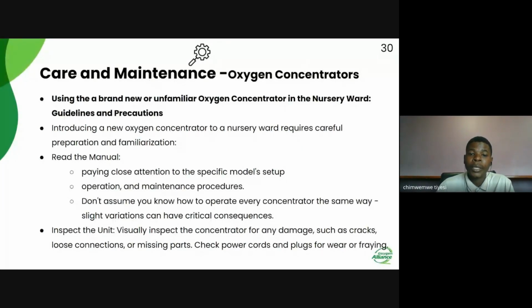Next, we are going to look at how you can handle brand new or unfamiliar oxygen concentrators in the nursery or neonatal ward. Introducing a new oxygen concentrator to a nursery ward requires careful preparation and also familiarization. So you should not assume familiarization. Even experienced healthcare workers may get this wrong.